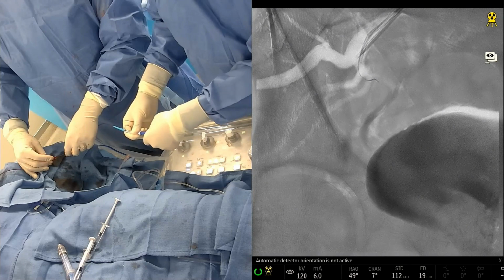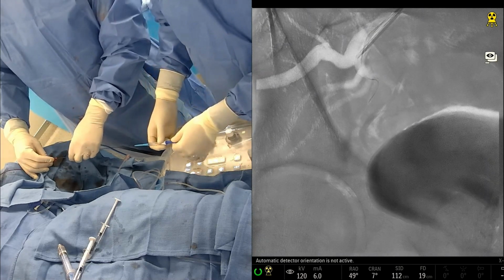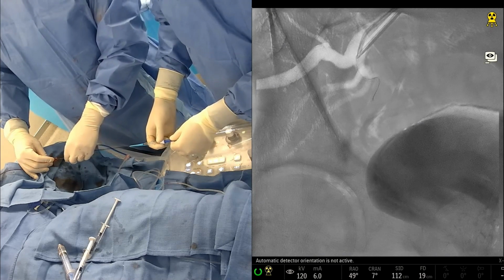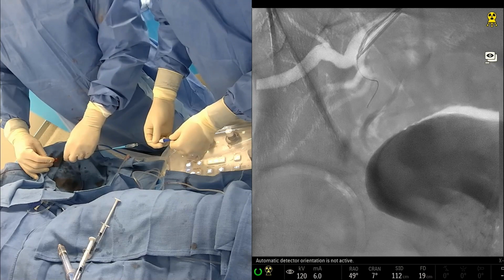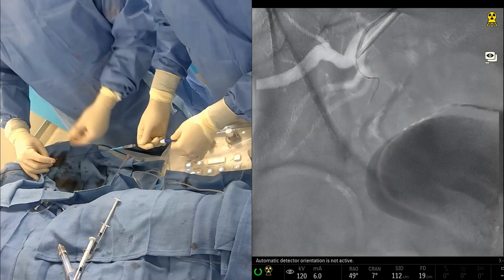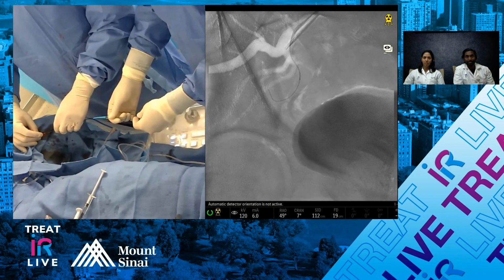Hey, you know what? Let me follow you. Put a little back tension on that so I can follow you in a sec. One thing about that True Select, it's trackable. You don't necessarily need that much wire ahead of you. There it is. Look at that. Nice. That's awesome. Alright, see if you can get a little more wire in. Yeah. Just needed a little.